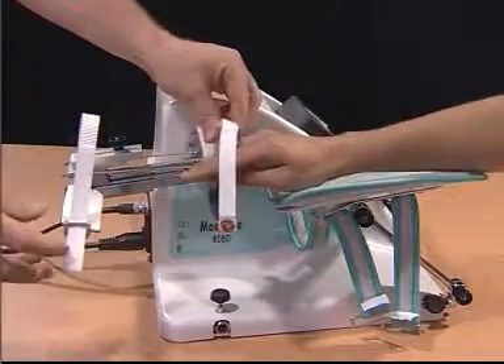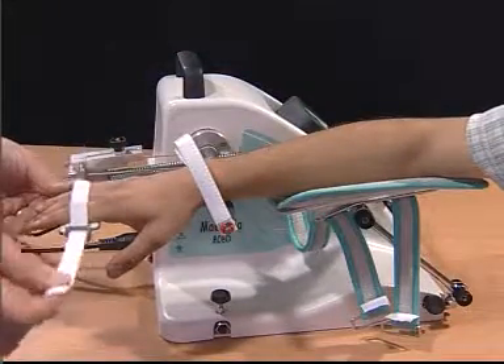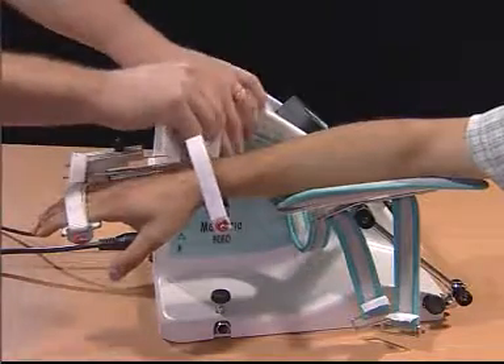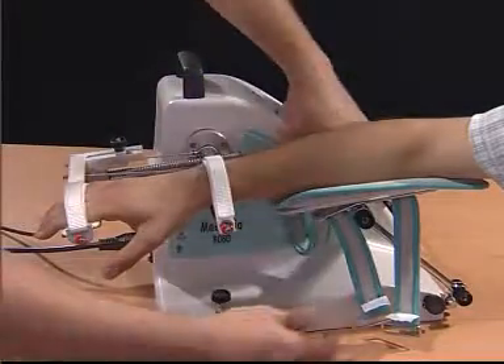Place the patient's extremity into the device. The palmar support will be over the proximal phalanges of the digits. Secure the extremity in place.